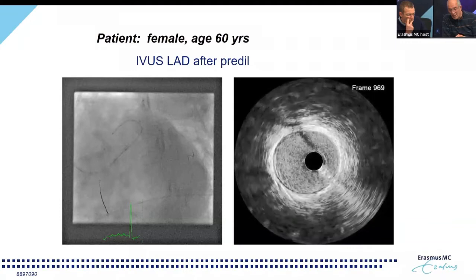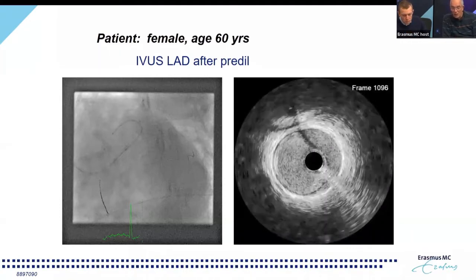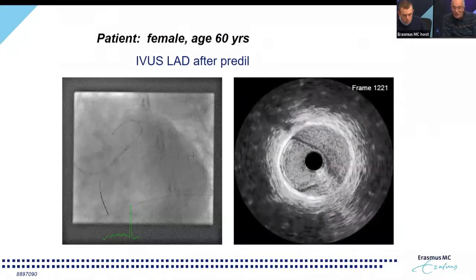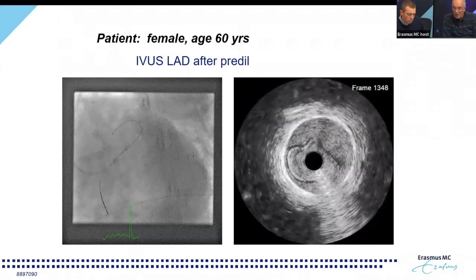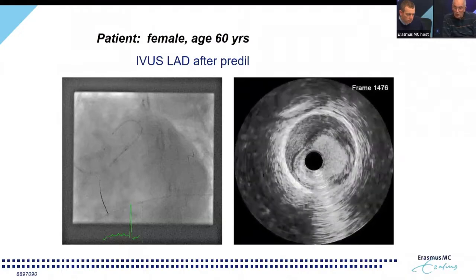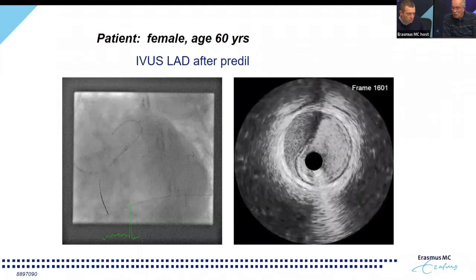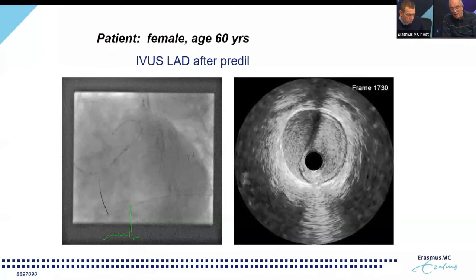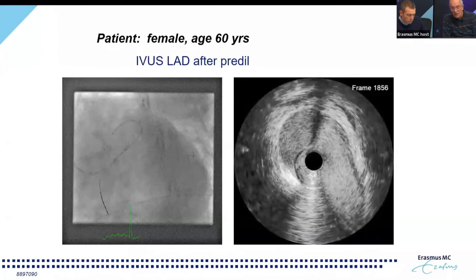And we see here that the media is still loose from the wall. So we have a submedial hematoma in there. But if you would place a stent in this vessel, then you're okay. Then again, size your stent on the spot, preferably not where the vessel is blowing up due to the hematoma, like here. You have to make a realistic sizing.